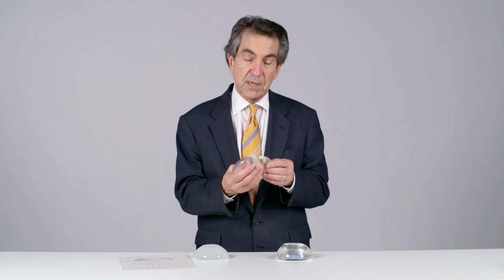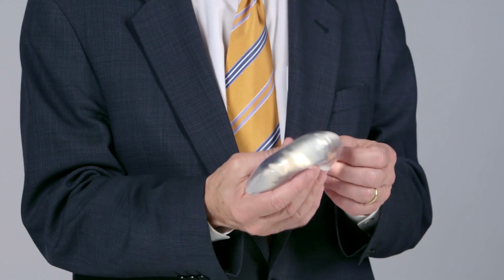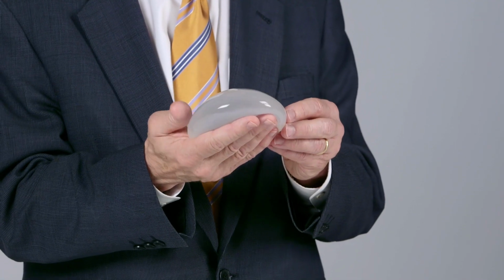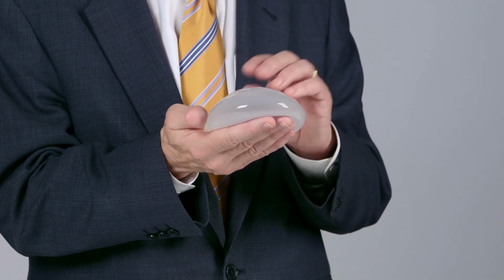A word about volumes when you're replacing implants, something many people don't realize, is for the original saline implant, the shell is not included, and the shell is about 20 cc's. So if your chart says a woman has a 300 cc saline implant, she really has 320 cc's in her body. The silicone gel implant includes the shell. If it says 300 cc's, it's the whole thing. And the Ideal implant is labeled the same way. It says 300 cc's, it's the volume of saline inside, the inner lumen, the outer lumen, and all the shells. That makes up the total volume.